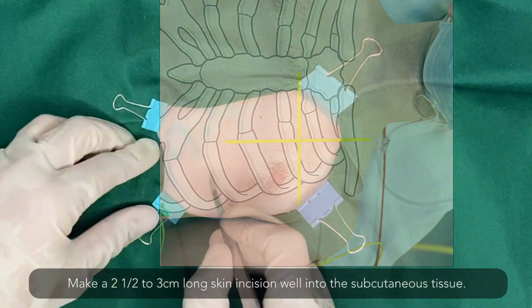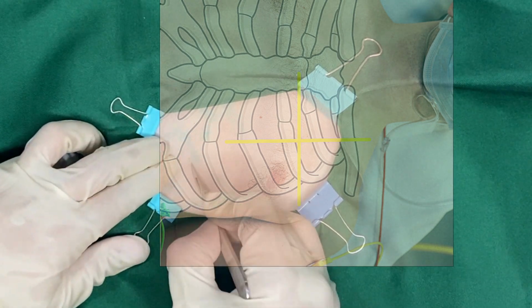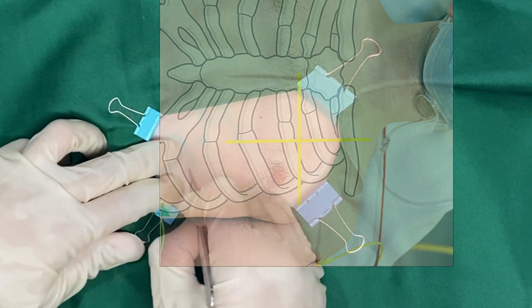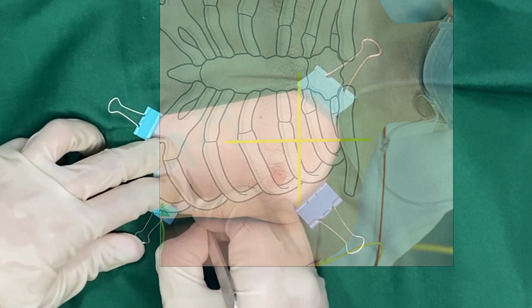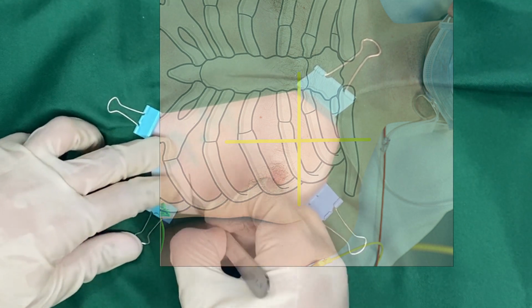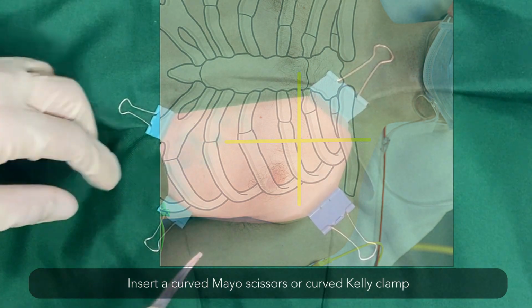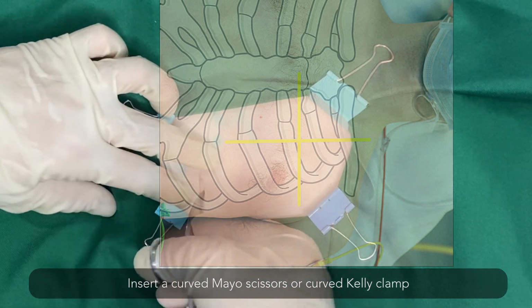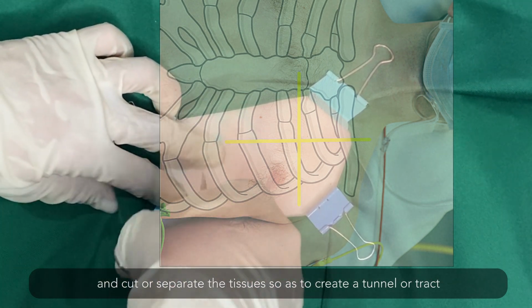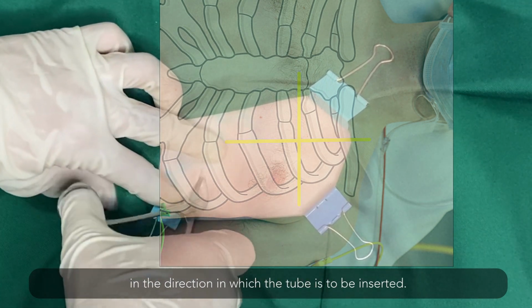Make a 2.5 to 3 cm long skin incision well into the subcutaneous tissue. Insert a curved Mayo scissors or curved Kelly clamp and cut or separate the tissues so as to create a tunnel or tract in the direction in which the tube is to be inserted.